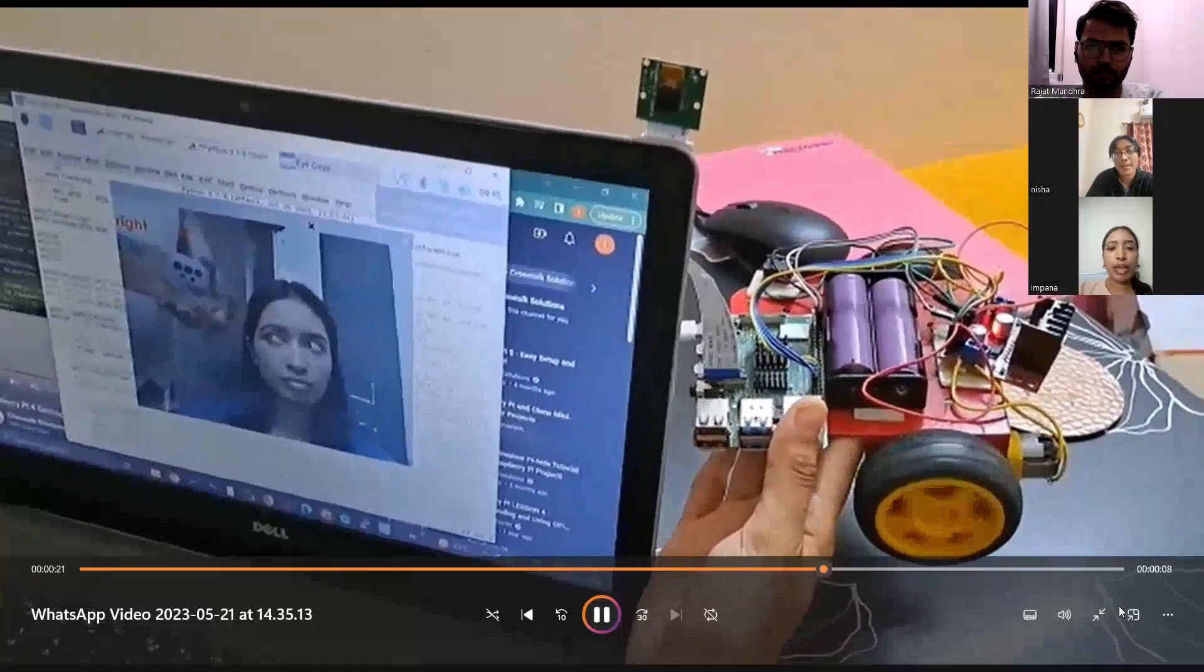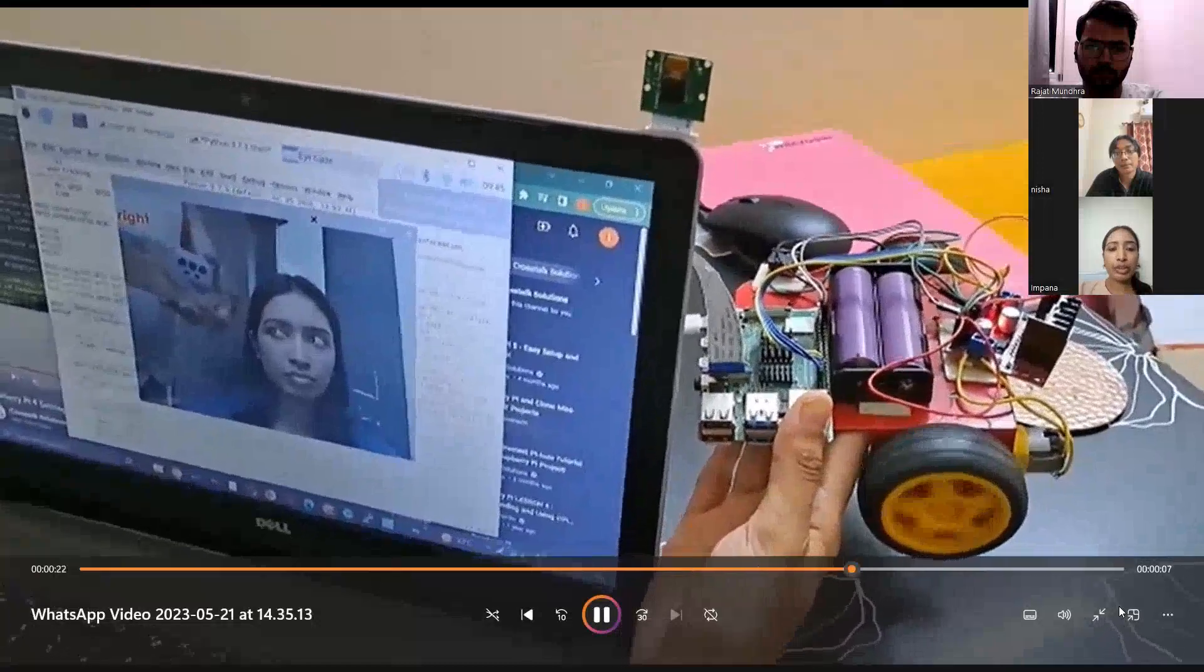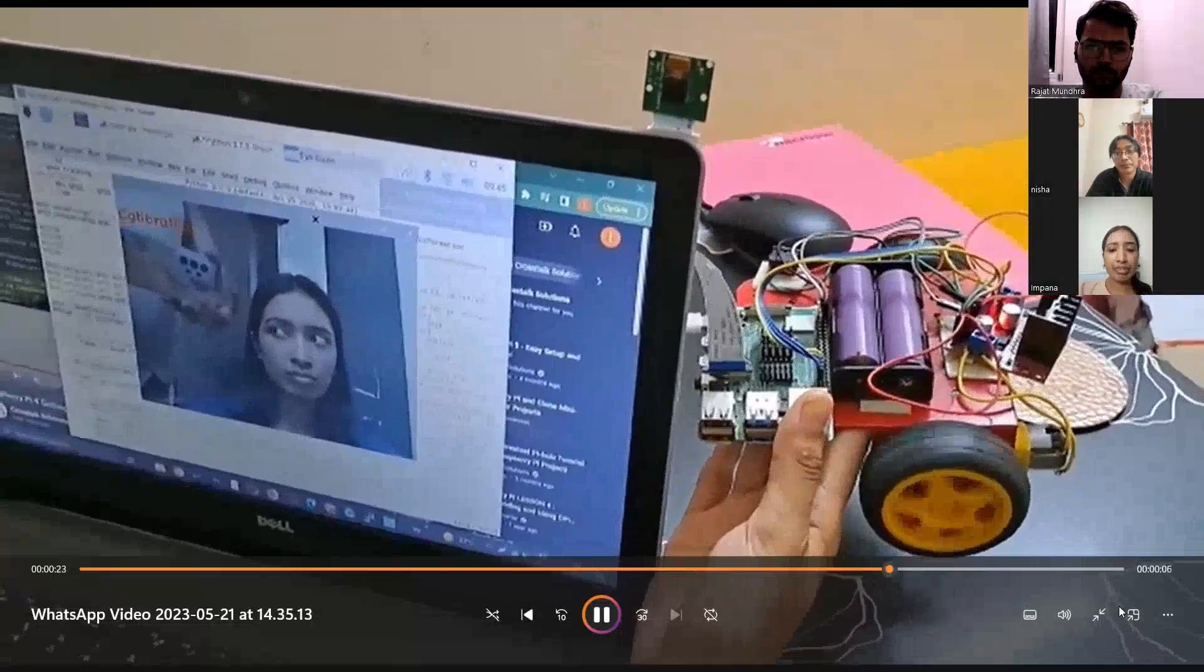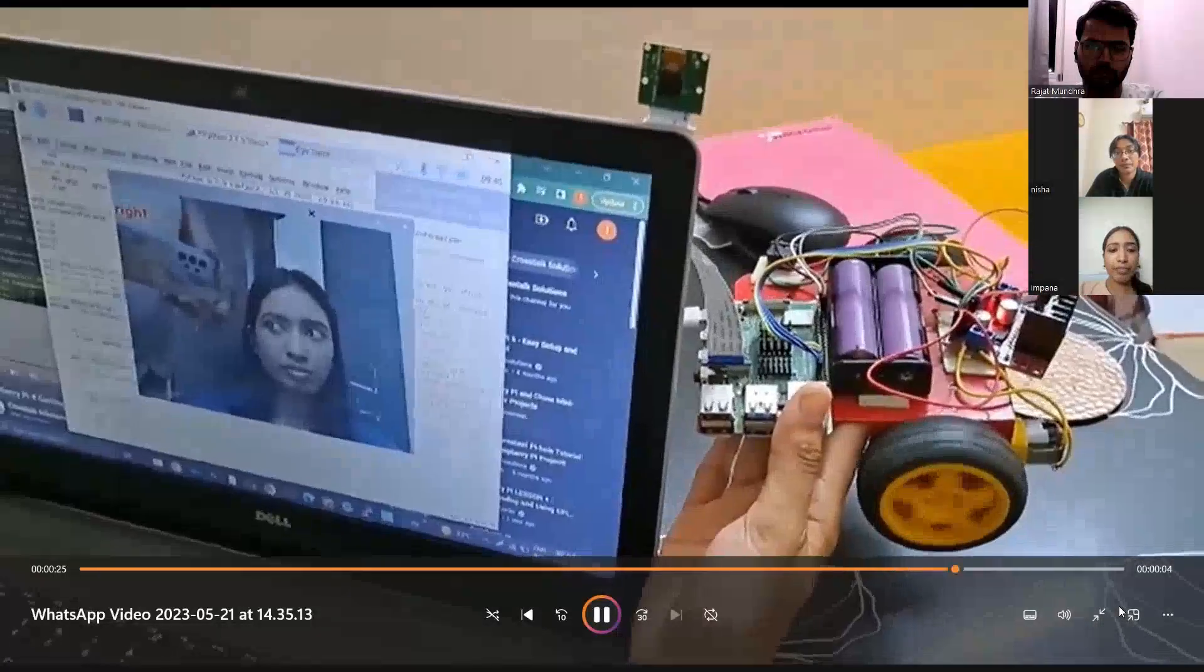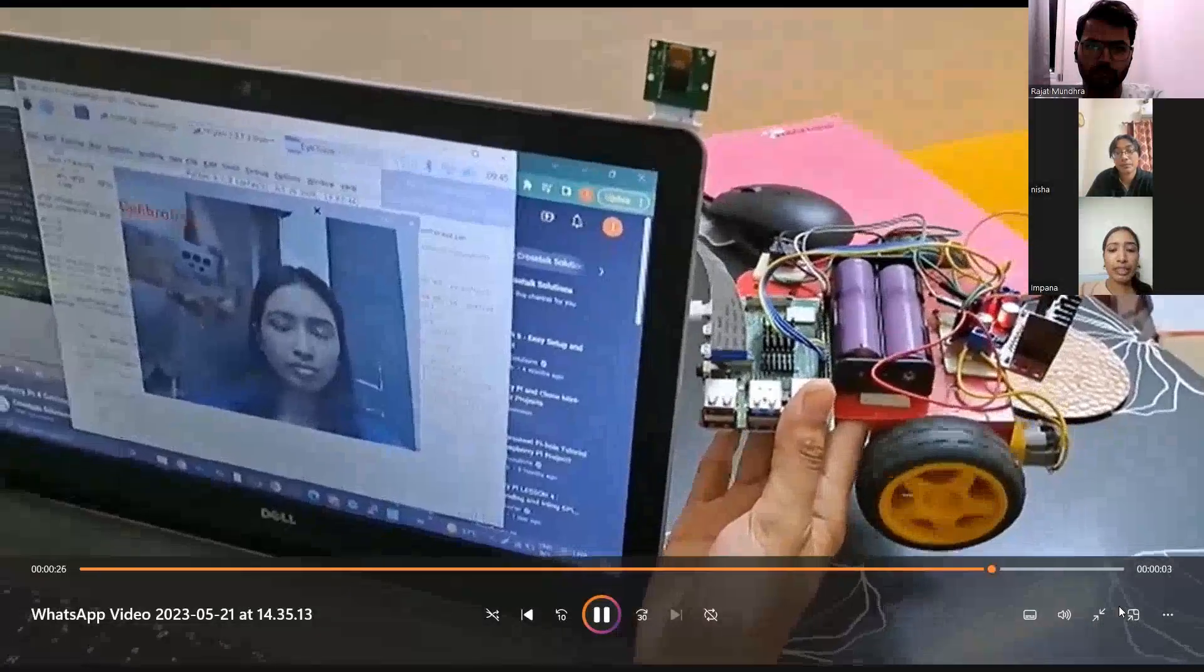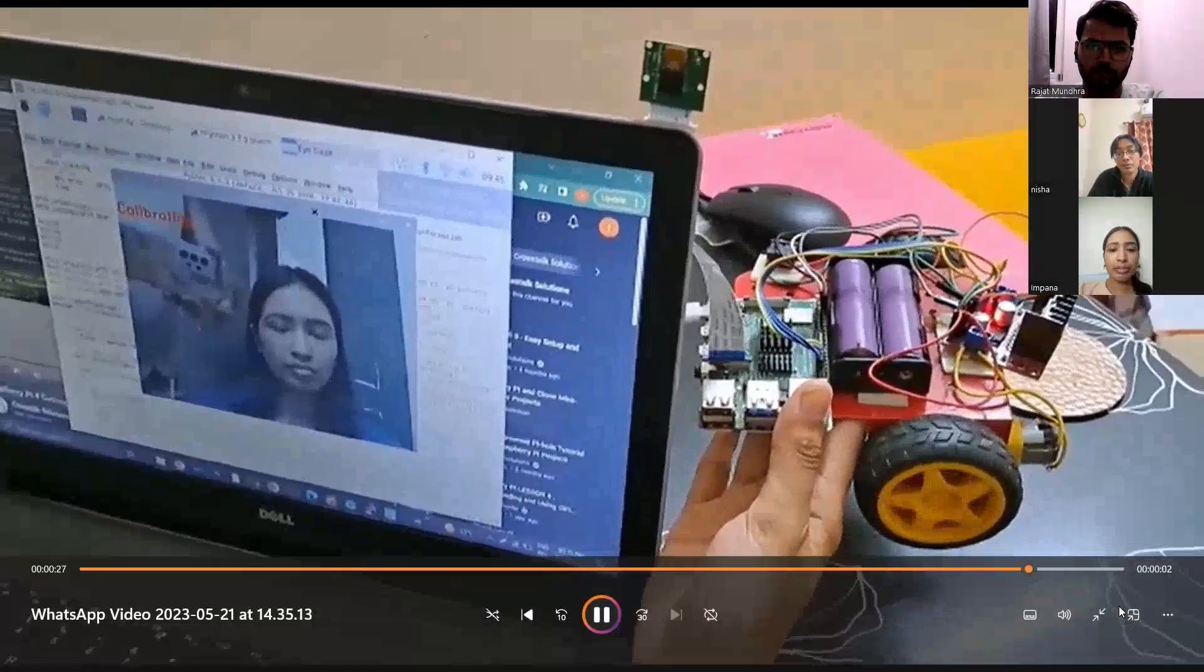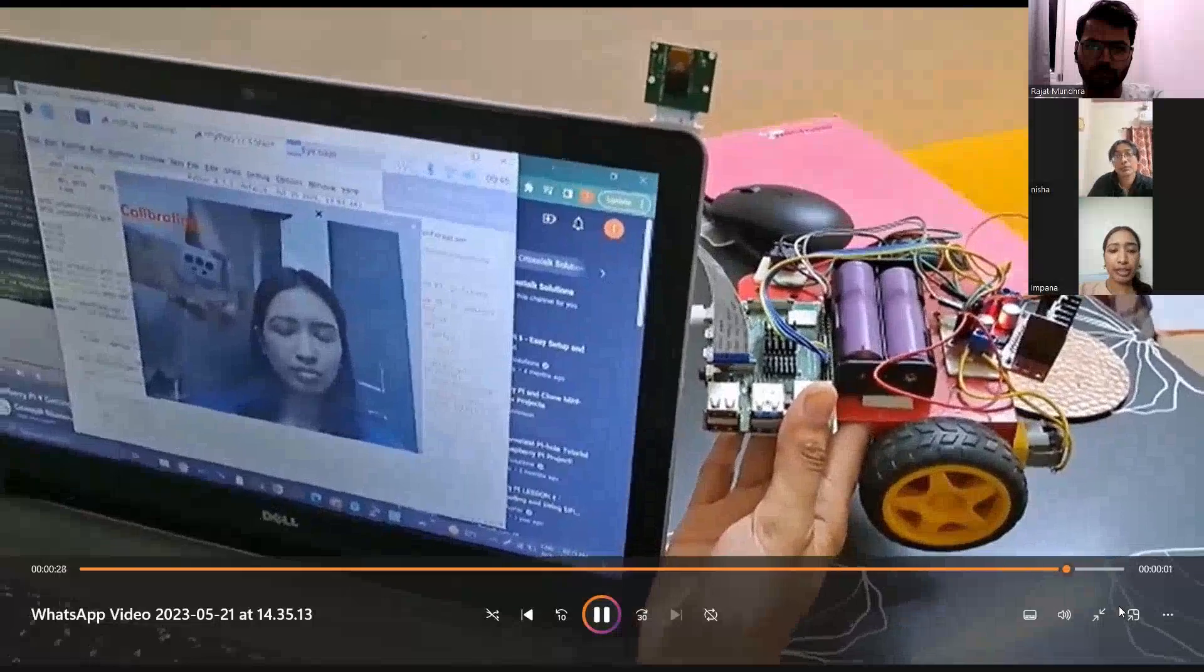It's the left. On the screen you can see it detects that it's left and the wheels move accordingly. The right direction, it moves to the right accordingly.